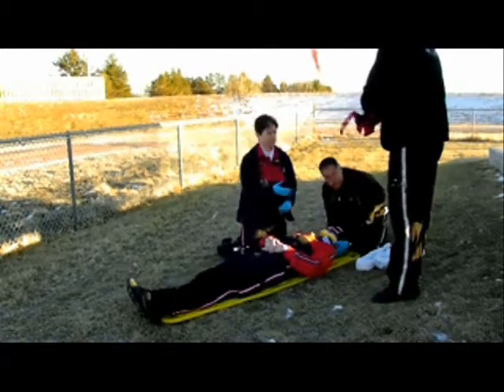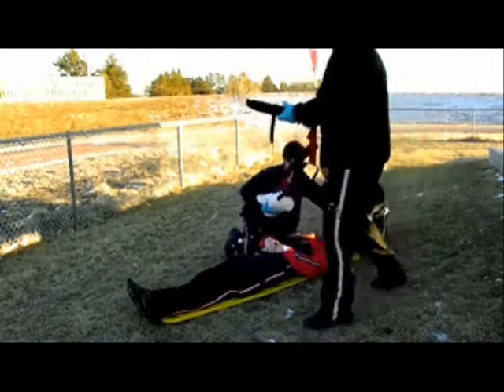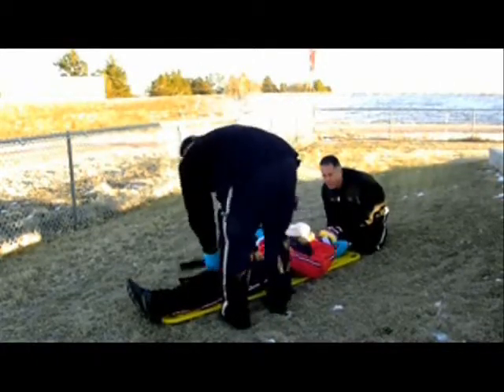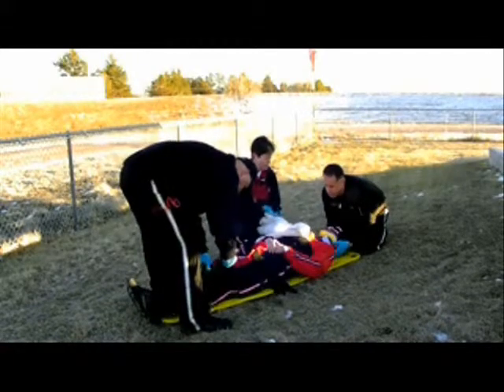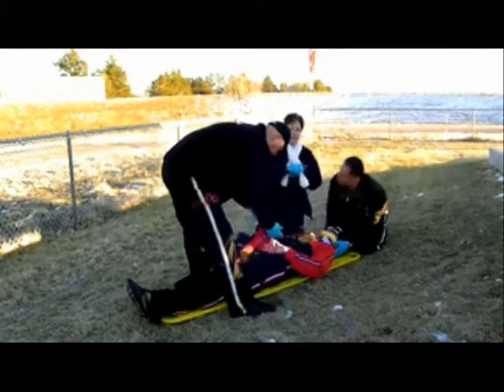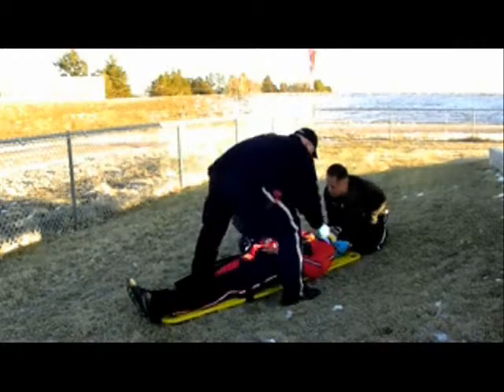I'll go ahead and let Clint immobilize his body. I'm going to talk about a couple other things we can use to immobilize people. Let's say, for instance, Jason has no neck and you can't fit a cervical collar on appropriately — there's always towel rolls. If you have a child, or a larger person with no neck, you can go ahead and wrap it around them like this and try to immobilize them that way.